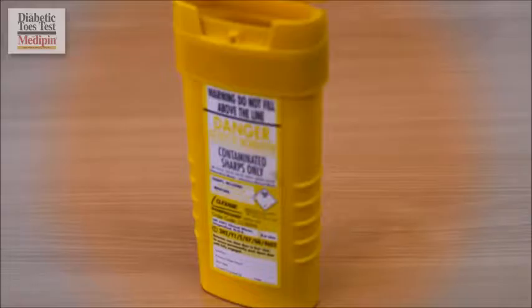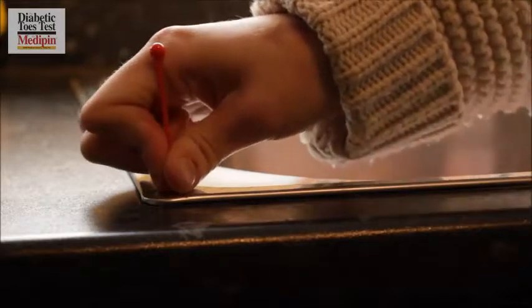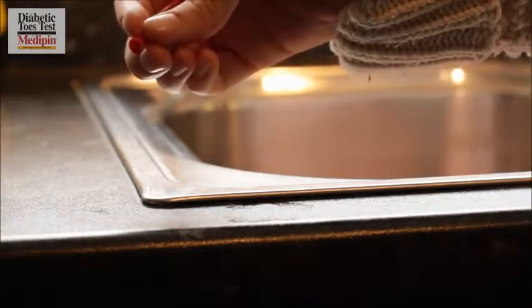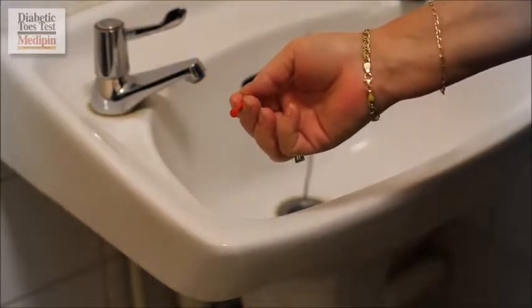Number four: finally, disposal. Though not really sharp, dispose of the Medipin safely. It can go either in a sharps container if you have one, or you can make the point safe simply by compressing it — just flatten the point against a robust surface such as the bathroom sink.